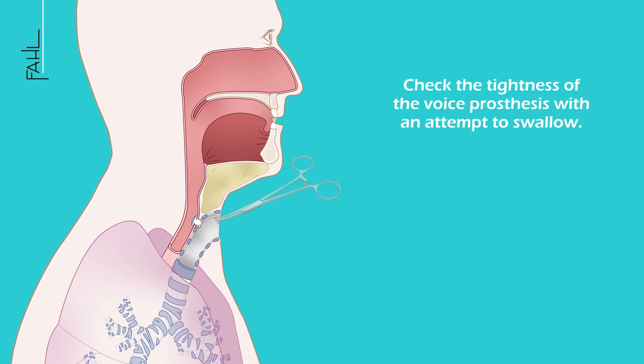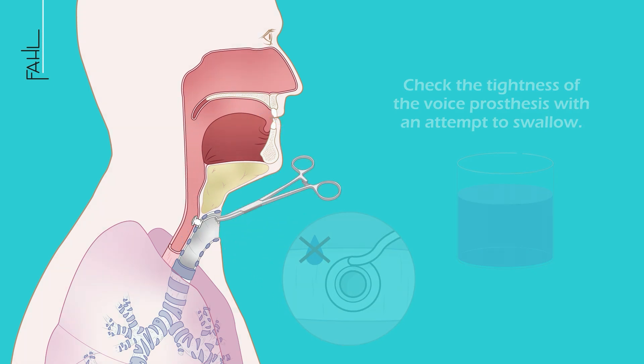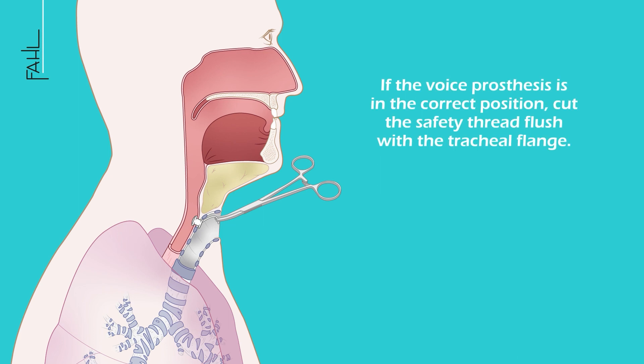The tightness of the voice prosthesis is then checked with an attempt to swallow. If the voice prosthesis is in the correct position, cut the safety thread flush with the tracheal flange.